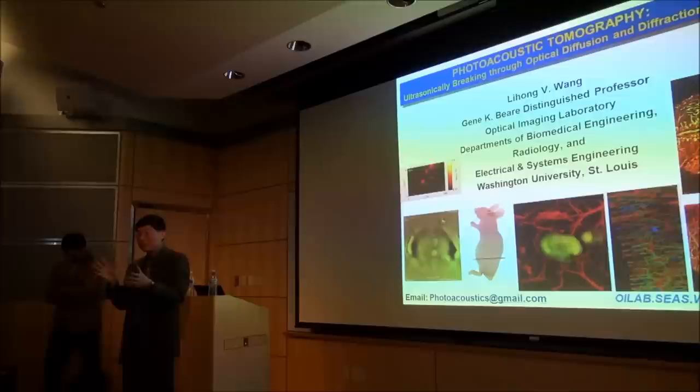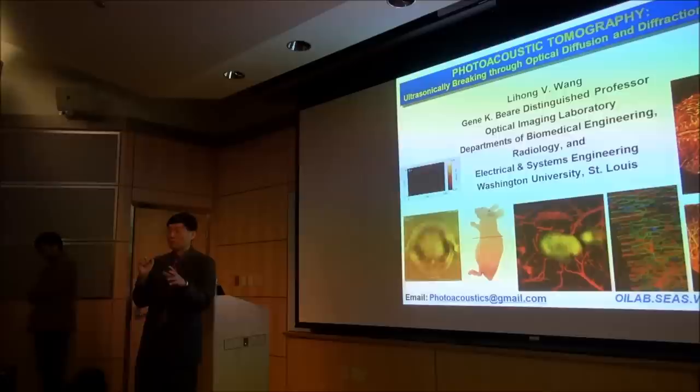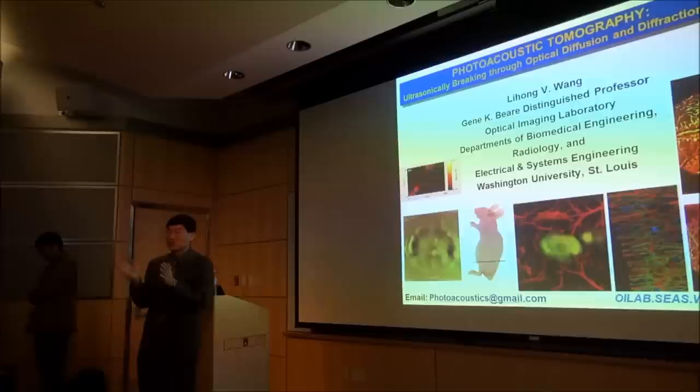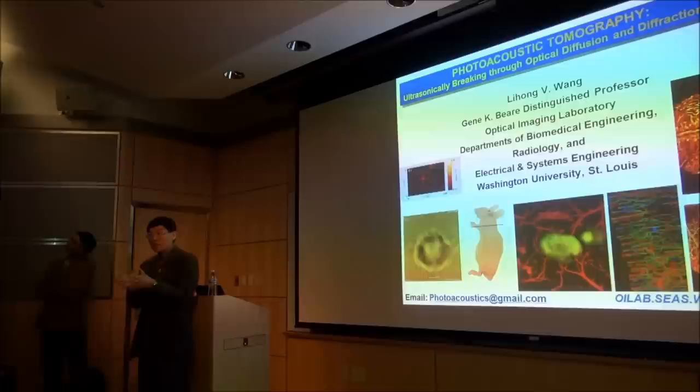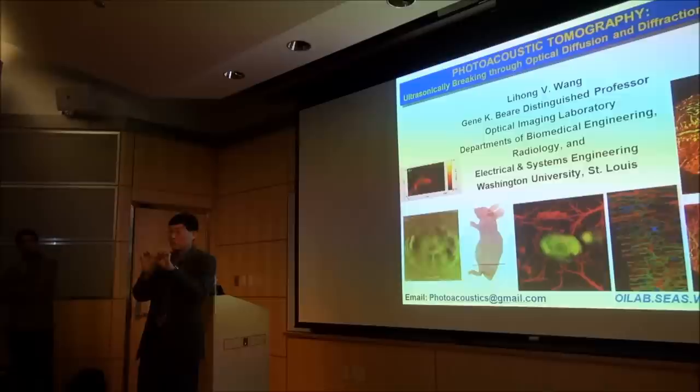In fact, you can prove mathematically the fluence distribution is continuous as long as the tissue refractive index is the same, which is a very good approximation because the index variation is on the second decimal point in biological tissue. But we're looking for some non-invasive methods. We've had some success already, especially in the microscopy world, either acoustic resolution or optical resolution. In blood vessels, that's the major interest.